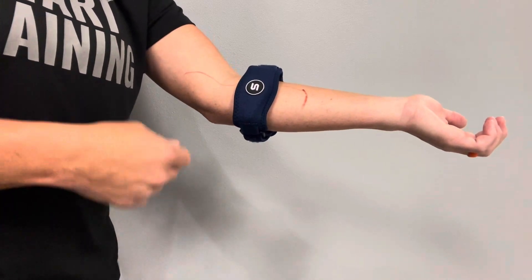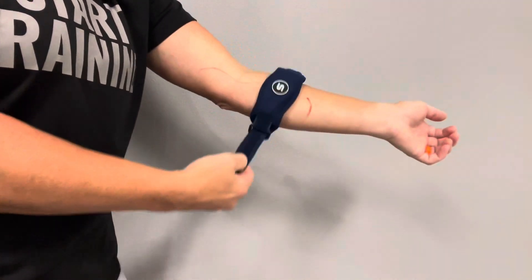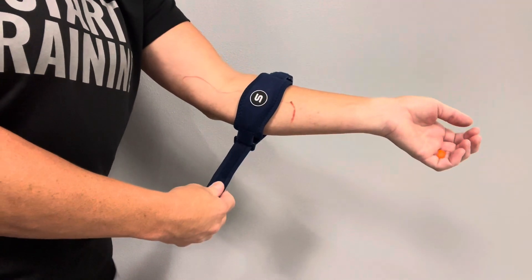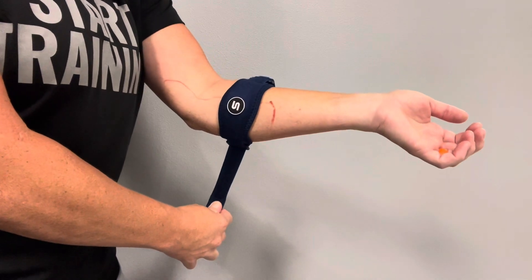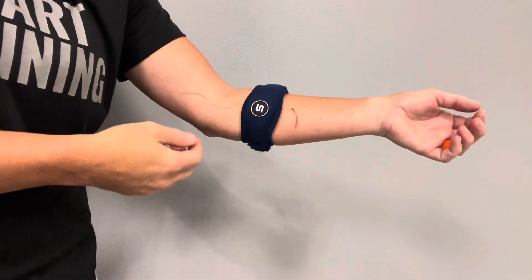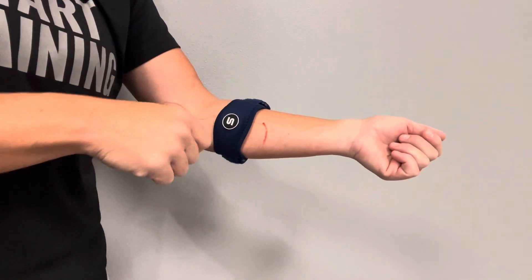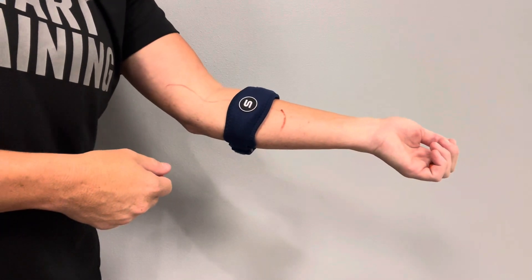Now when we pull it — this is the important part — you want to take the bottom strap and pull it downward to secure the brace. We don't want to pull it upward, because that's going to pull the muscle away from the spot we want. You'll know you did it wrong because it won't feel great, but if you do it the correct direction it'll feel all right. So we're going to pull it down.